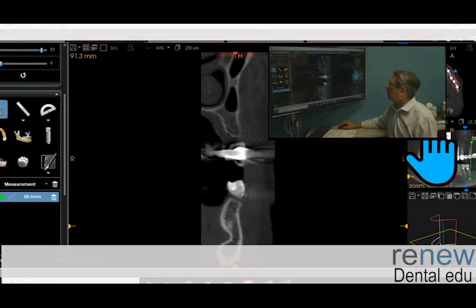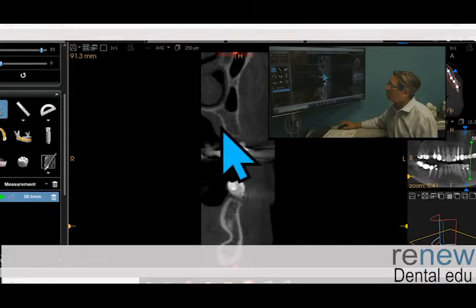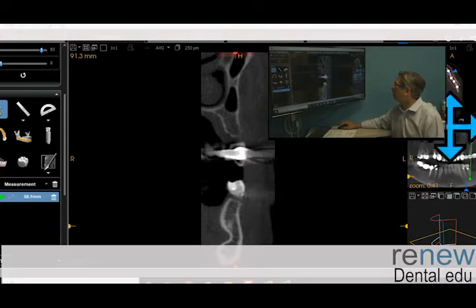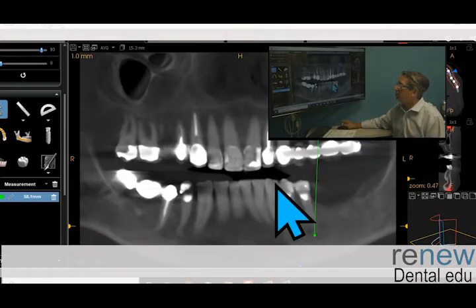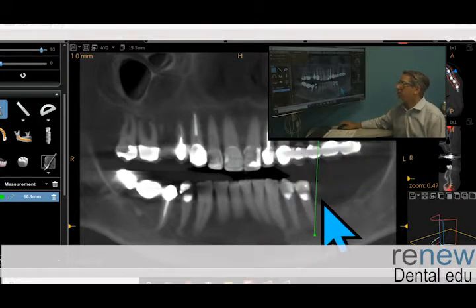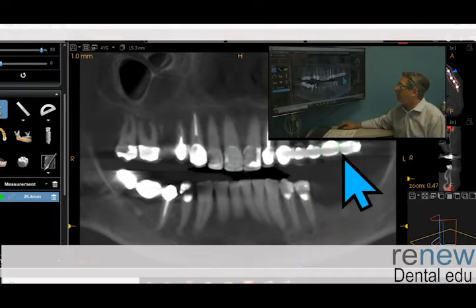So think about that. Look at the density. Look at the density. Compare the two densities. You know this is soft, so this is going to be just as soft. So getting bone here, hoping that an implant is successful, it's a bit of a challenge. It's definitely a bit of a challenge. So hopefully she doesn't have any medical history issues that you have to worry about, but that's how this could be restored. This patient is also, on top of all this stuff, very vain.